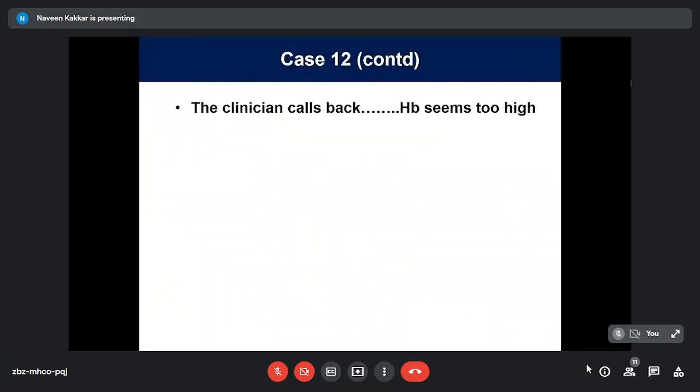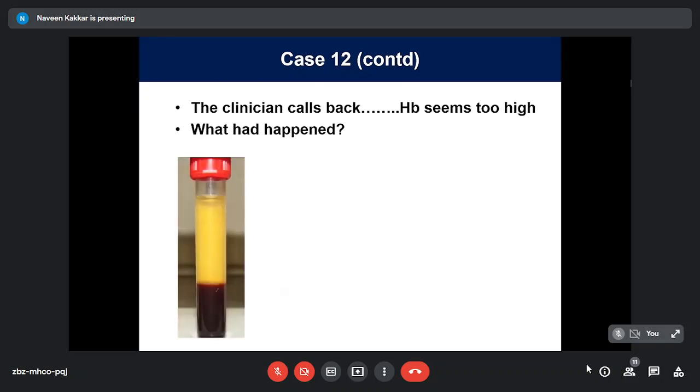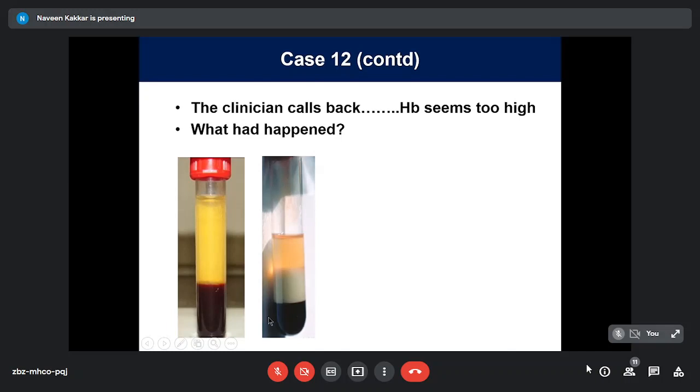Now the clinician calls back and says the hemoglobin seems too high. He's seeing marked pallor, and we are giving him 10.8. So what had happened? A normal sample, if you leave it undisturbed or spin it, you have the red cell column and the straw-colored plasma, more yellow in this case though. And this is a patient with CML. You have the red cell column but a huge white cell column. Count is 3.6 lakhs and a little bit of plasma.